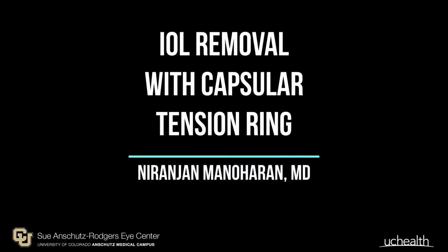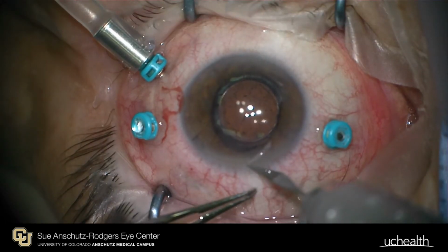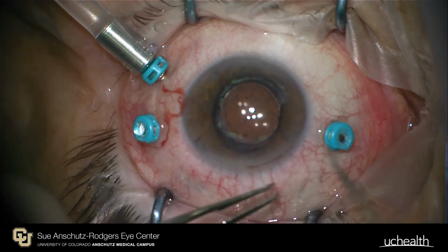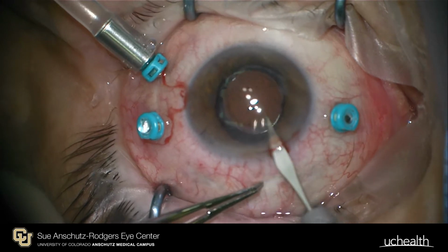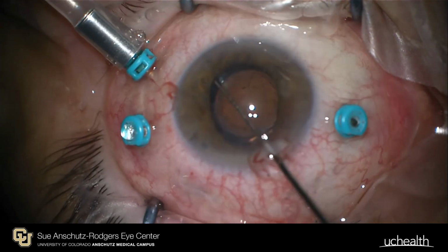IOL removal complicated by the presence of a capsular tension ring. This was a patient with anterior PVR with ciliary body detachment and hypotony. Prior to anterior base dissection, the IOL was planned to be removed.